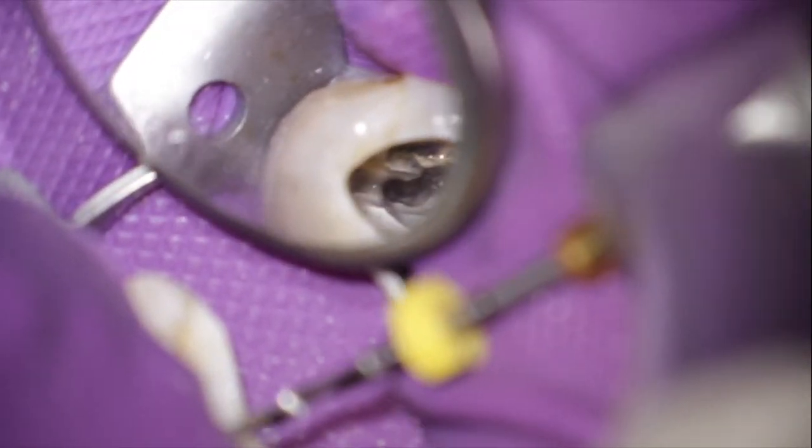The next case is an example of how stupid one can be. This is a nice example of what you should avoid doing. It is an upper second molar where you can see the buccal and the palatal canal. The two canals that you can see are confluent apically, and the palatal canal makes a sharp turn into the buccal canal. So far so good.